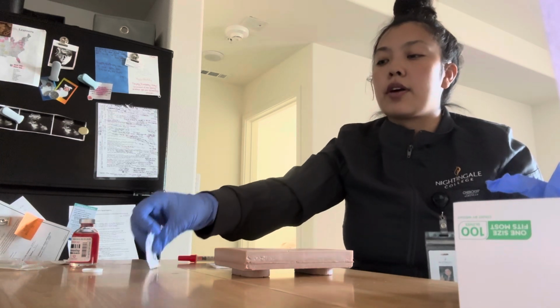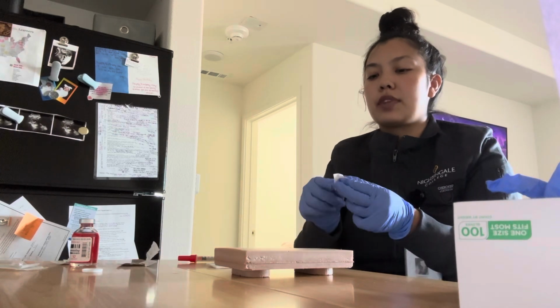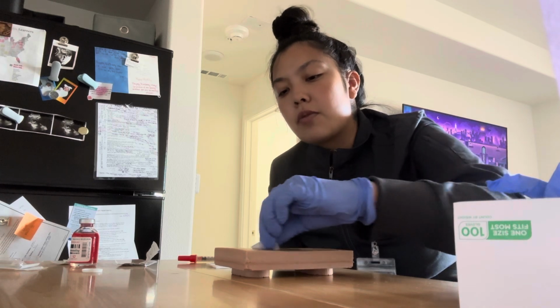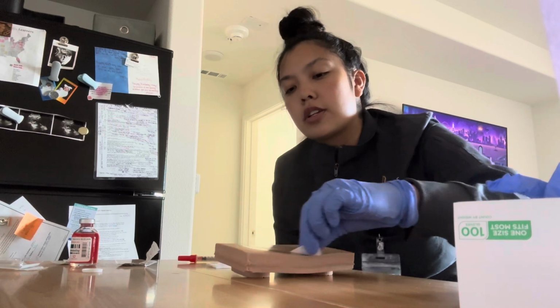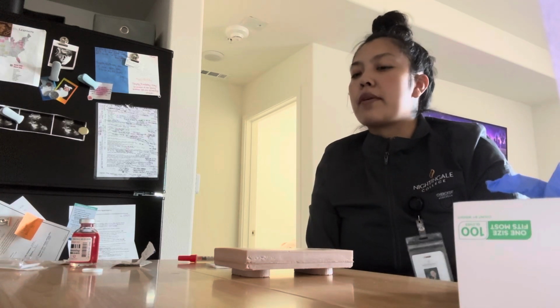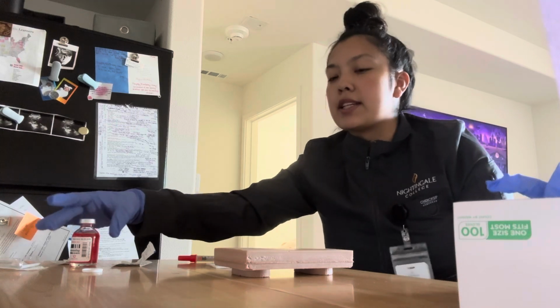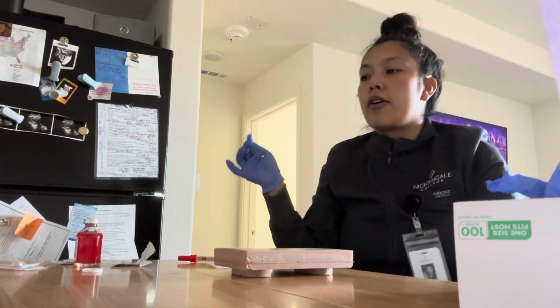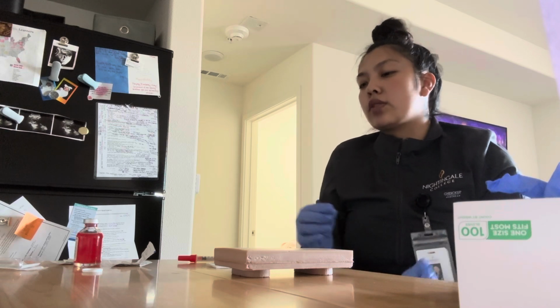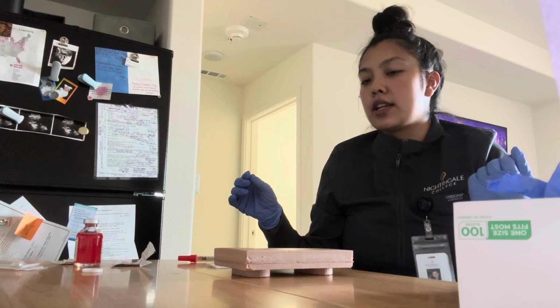So now I'm gonna go ahead and do another alcohol prep pad. I found my spot. I'm gonna clean it outwards and discard of that. So now I'm gonna go ahead and let that dry without me swishing or anything. And this will be the last time I check the medication. Okay, I have the correct medication. Alright, so the next thing that I'm going to do is inject the medication.